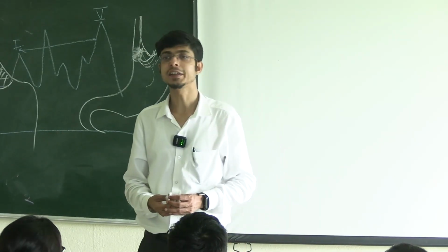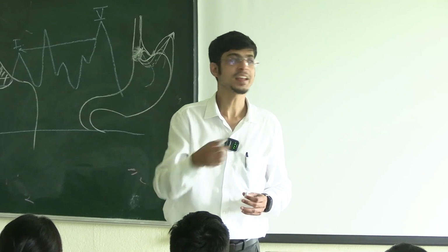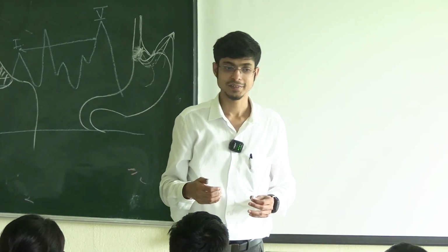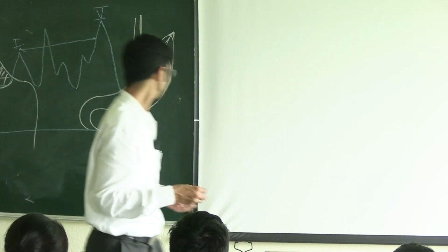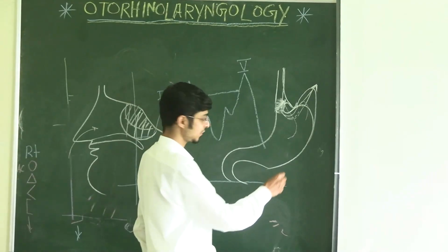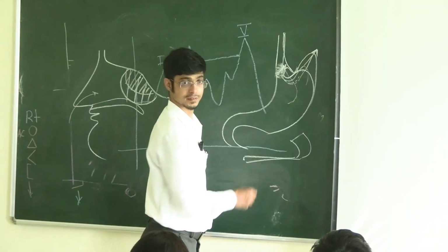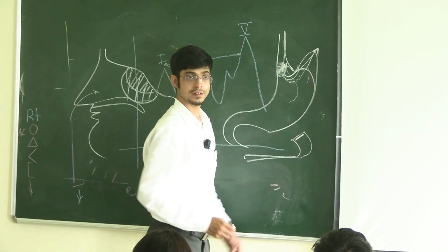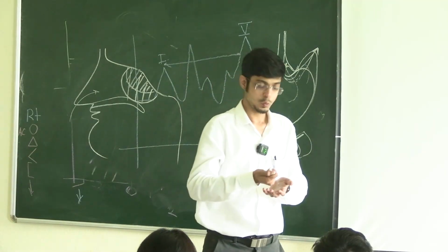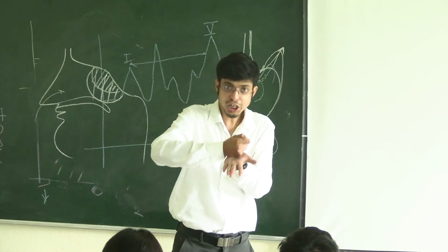So now we take something called an adenoid curette. So it's like a saw basically. Okay. Have you seen an adenoid curette? It basically looks like this, and a blade over here. So we go in, we try to hook the adenoid tissue inside this blade and shave off the adenoid.